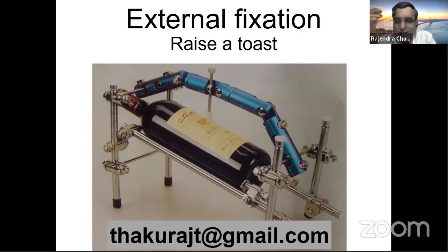Alok, in your experience, how is external fixator in the current scenario? Are you using it for any definitive treatment? Sir, I'm using it for LRS, and for distraction osteogenesis. And we are even using HTO fixator for correcting medial compartment osteoarthritis.